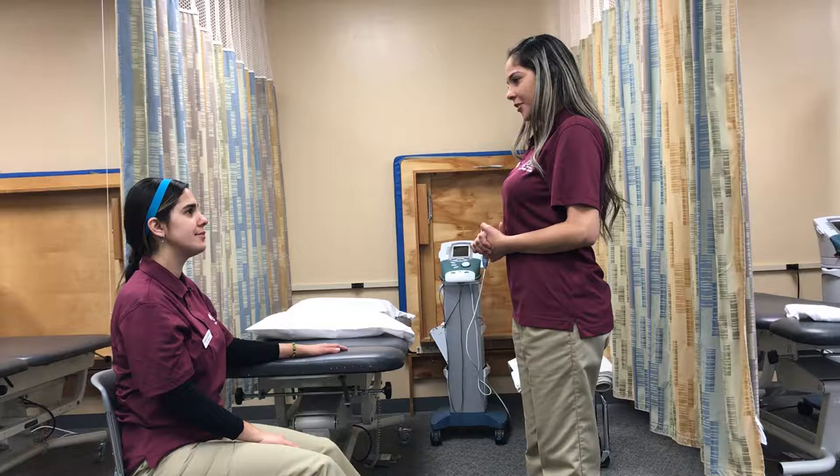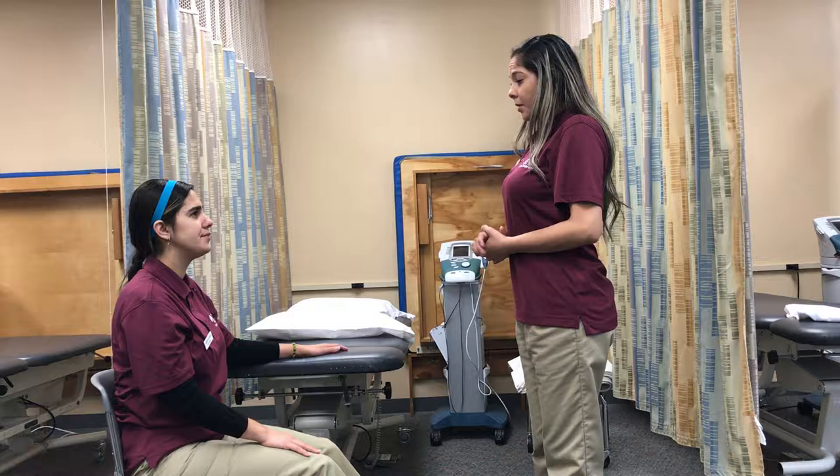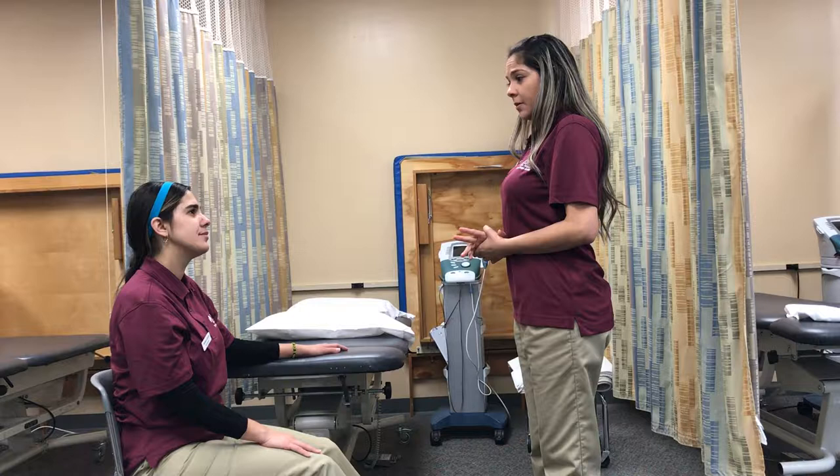How are you? Good. I feel just a little pain. I read on your chart that you have lower back pain for around four months. That's right. Okay, to help you with your pain, I will apply a hot pack to your lower back.